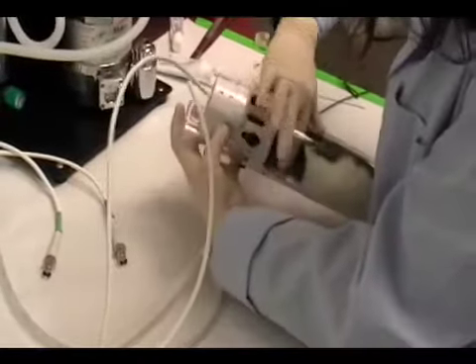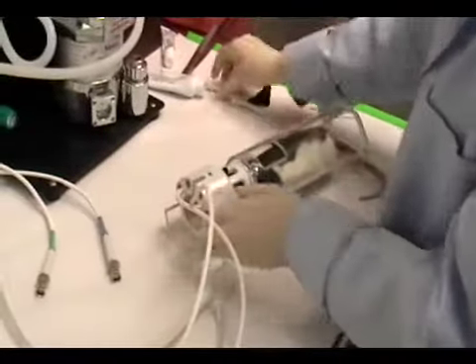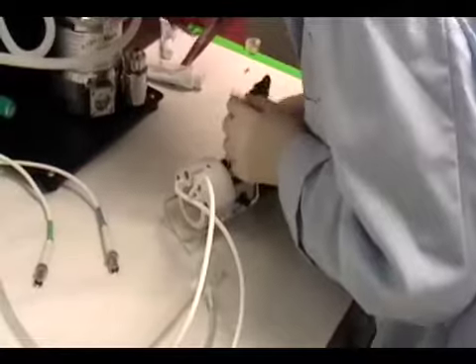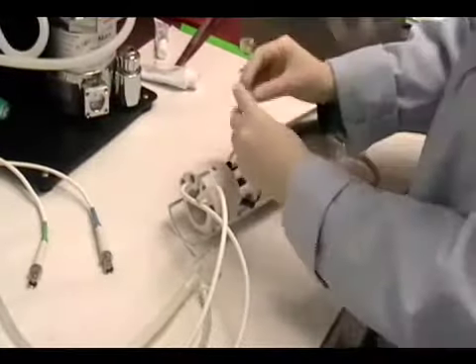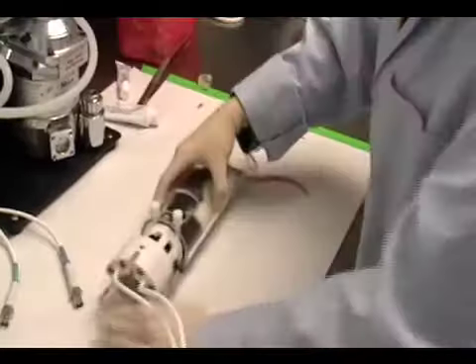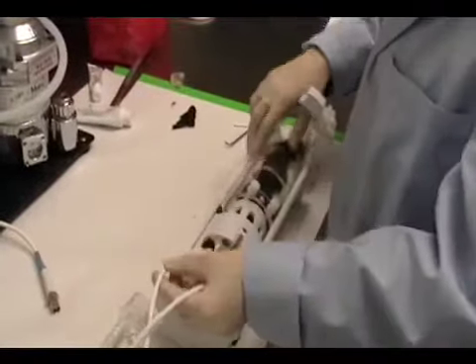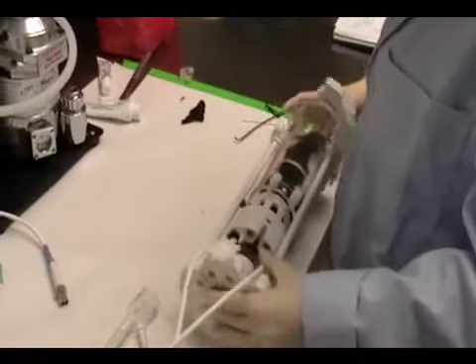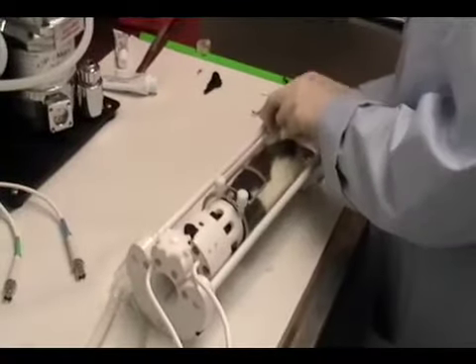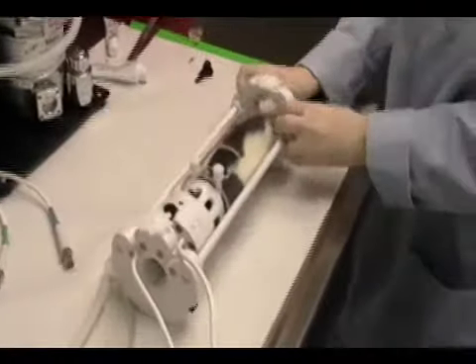The animal's legs are positioned below and back from its body, and two shoulder bars are placed in front of the shoulders. The body tube and quad coil are positioned into the chassis. The body tube is connected to the chassis by two screws from the back. The quad coil, on the other hand, is connected to the chassis by one screw from the front.